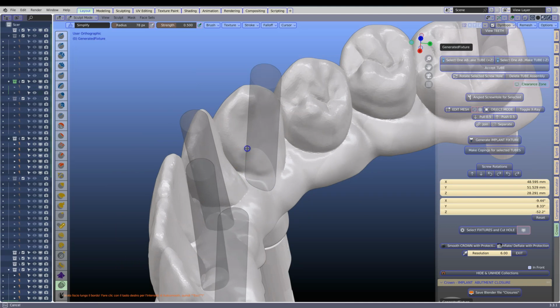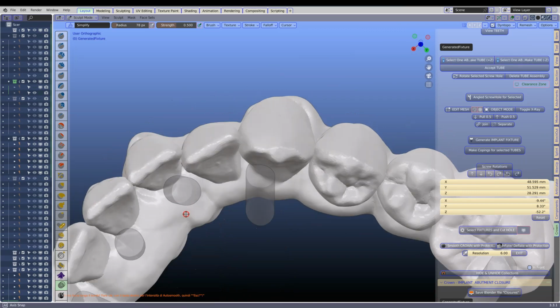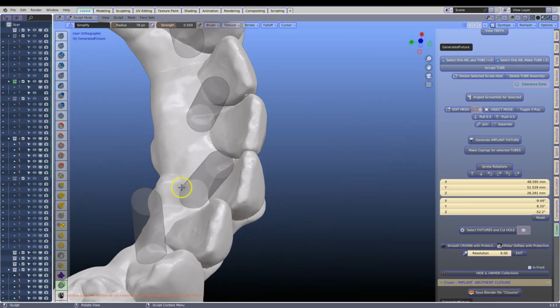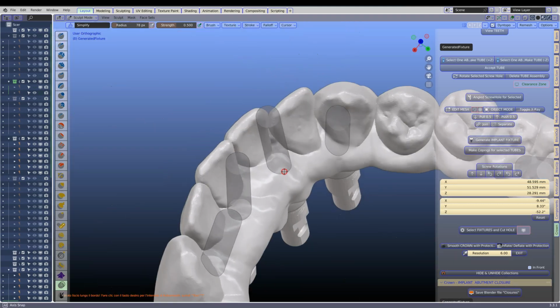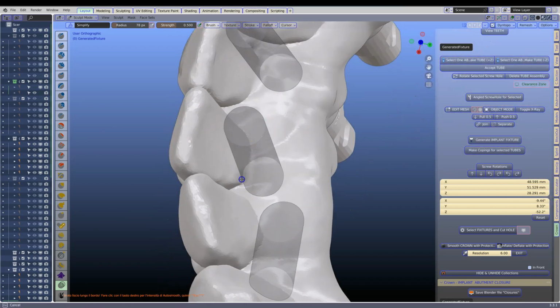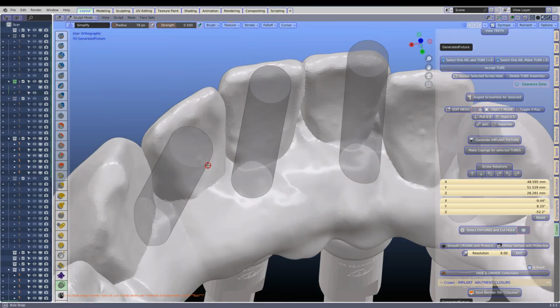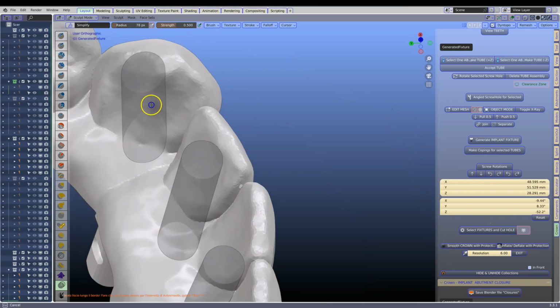You can already see that the geometry looks way better over here as well, especially here where the teeth come together. And over here as well. So we'll just smooth around that screw hole. So when it cuts it, we've got a perfect geometry.